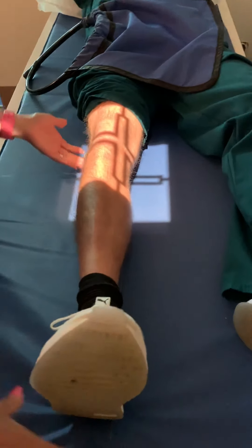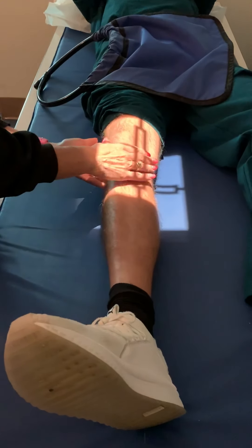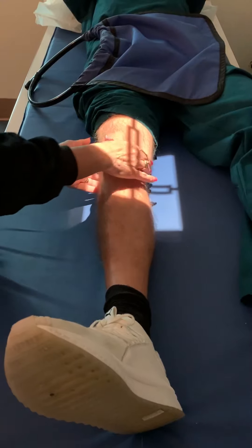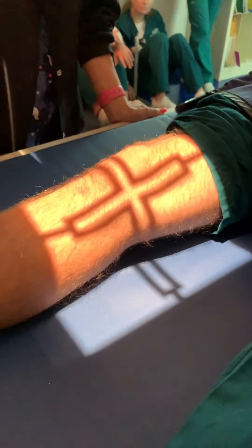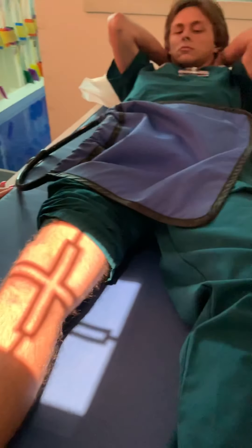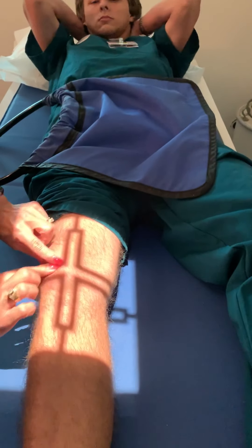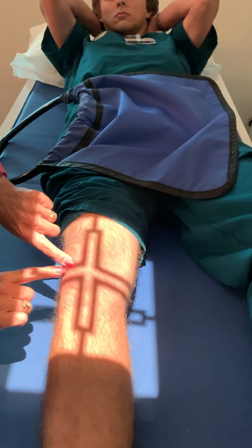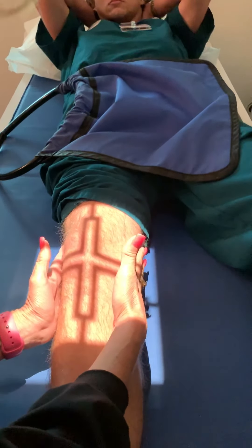Now we're going to take his leg and go 45-degree lateral rotation. You're going to palpate and make sure this forms a 45-degree angle with the plane of the IR. Remember, a perfectly positioned oblique would have the patella half on and half off the femur. Find the apex again, half an inch distal to that, midway on the leg.